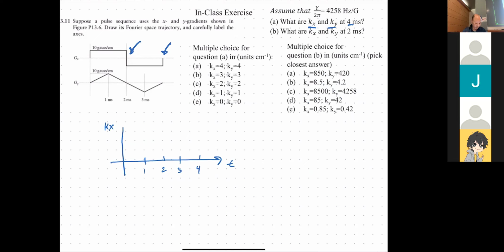If I integrate a constant, I just go up, and then that constant becomes negative, so I need to integrate down. That's what the waveform would look like. We're not going to calculate it, I'm just going to draw what the waveforms look like. Everyone okay with that?